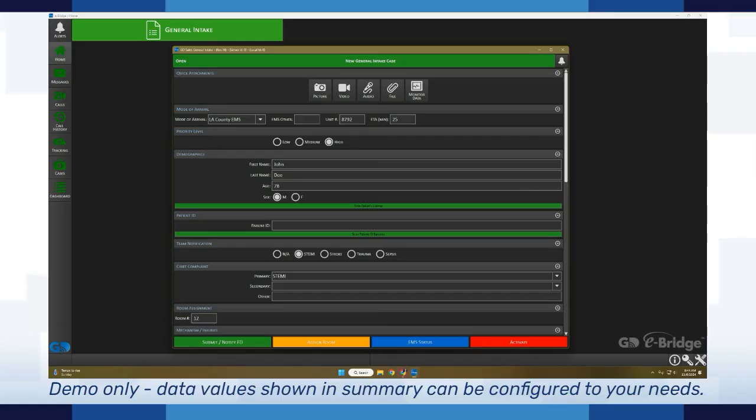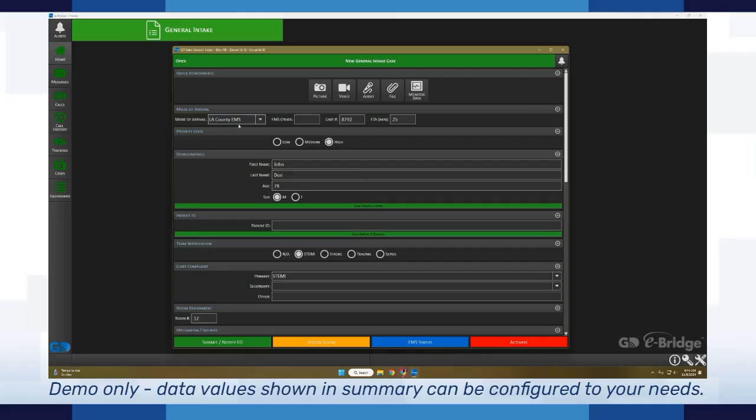As you can see here, I've got eBridge opened up on a computer. Let's say this is within the emergency department and we've got some information that was sent in to us that we're filling out. On this template, we've got mode of arrival filled out, an ETA, priority level, and patient name.